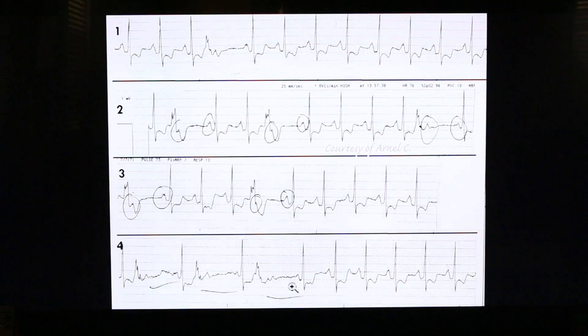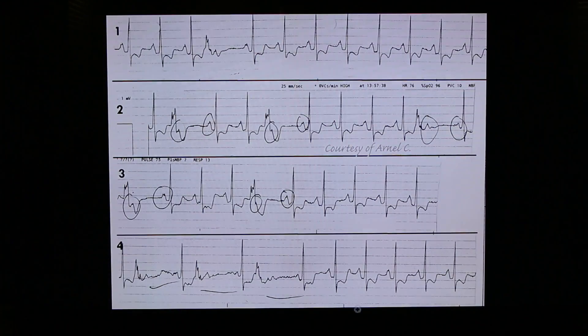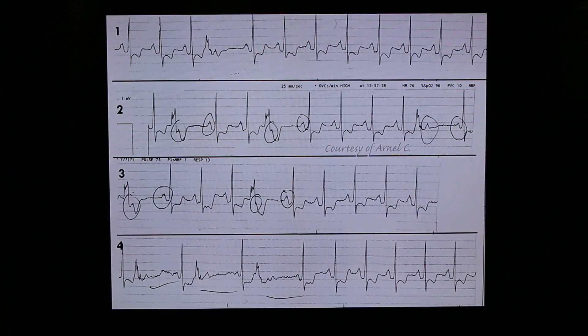Hello, this is Arnel of EKG Rhythms. Today I am showing you a strip that was read as 2nd degree AV block. Most likely it was read as 2nd degree AV block because of the block, or the non-conducted P waves.